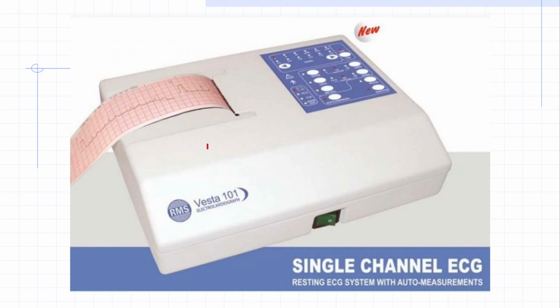So this is the ECG machine which records the electrical activity of the heart in each lead. This plastic coated heat sensitive paper is the ECG paper, which records the electrical activity with the help of a stylus, which gets hot whenever the electrical potential passes through it. It moves up and down, and that draws a black line on the ECG paper in the form of various waves, segments and intervals. It can be recorded manually or automatically. Nowadays computerized ECG machines are available, which record the electrical activities of the heart in all the leads automatically when the electrodes are placed on the particular points over the body surface.